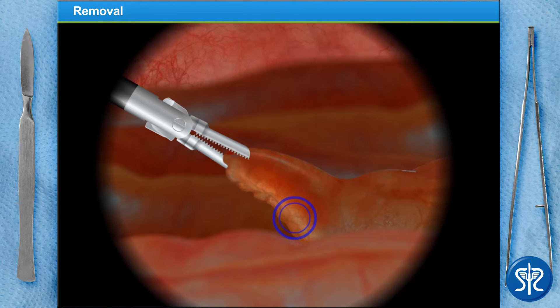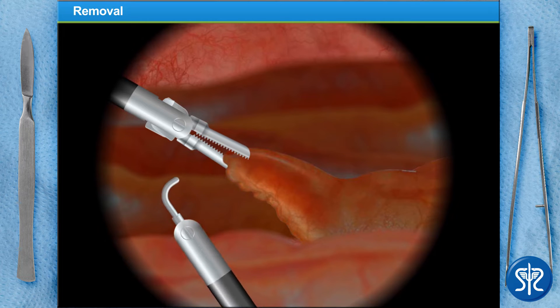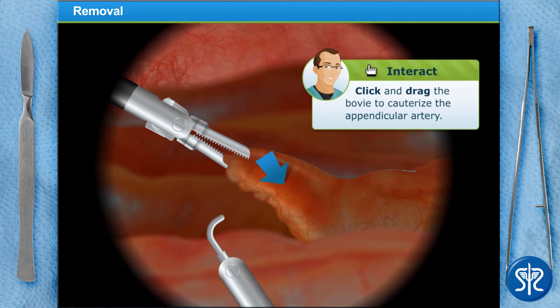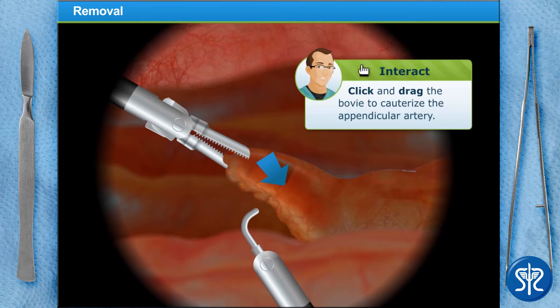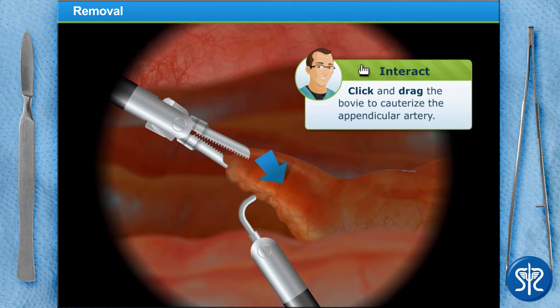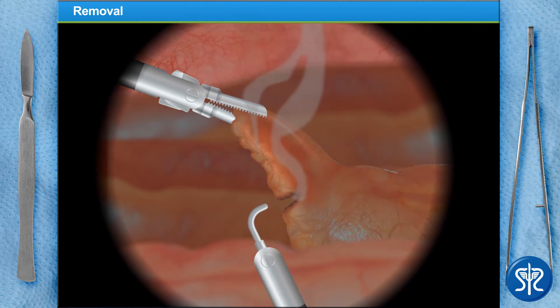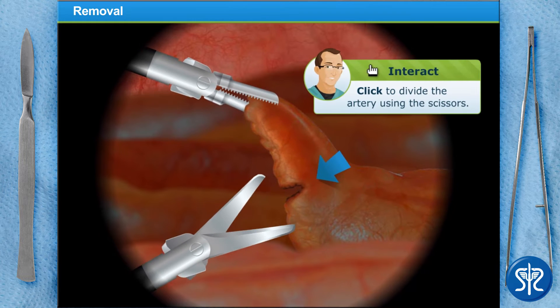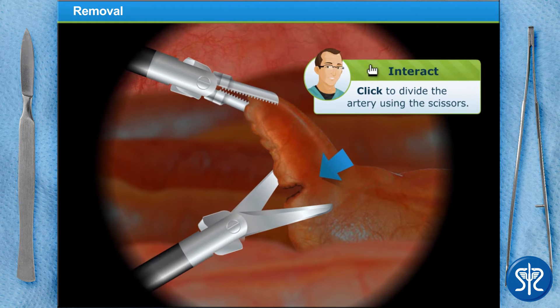The appendicular artery needs to be sealed using a diathermic instrument which uses extreme heat to cauterize the artery. The artery is then divided using scissors.